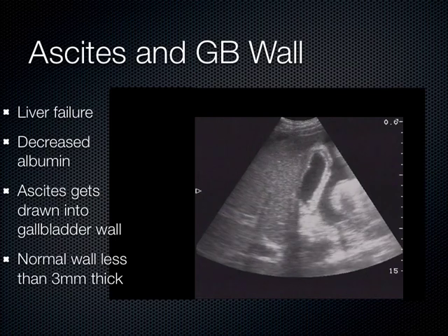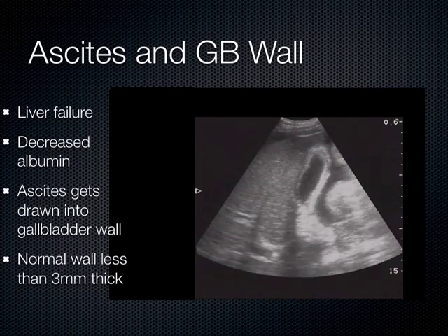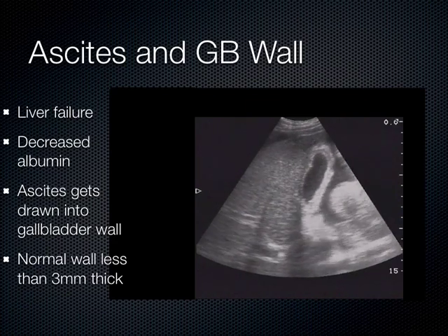So what happens when that happens is the gallbladder contracts down and the wall itself appears falsely thickened, which is why if I'm really curious about a patient's gallbladder wall, I want to measure it, I try to do it if they haven't eaten for at least 4 or 5 hours. That's the reason why we do that sometimes.